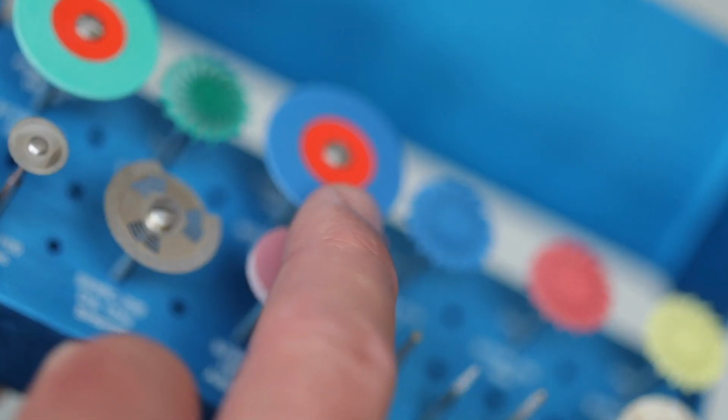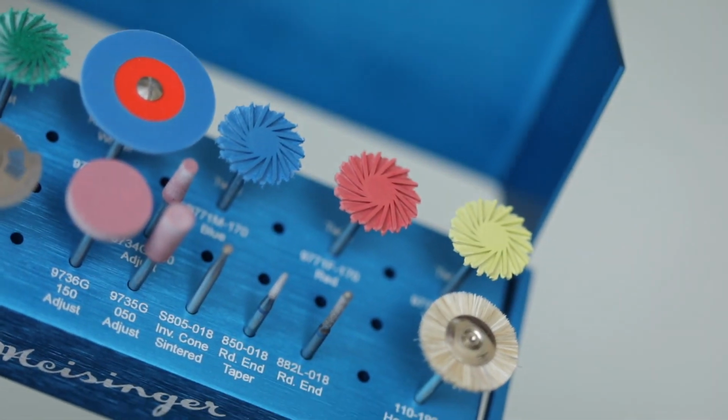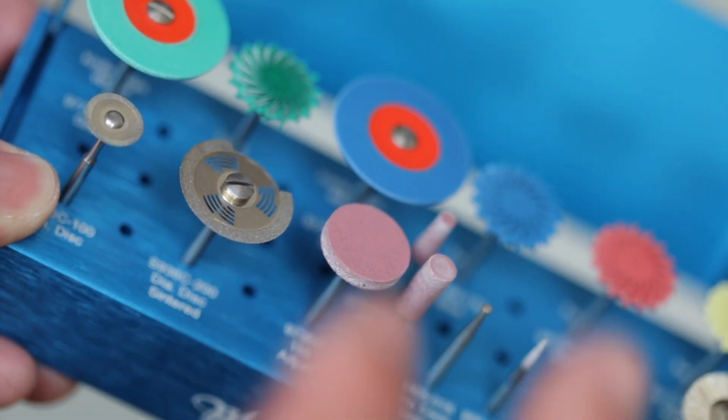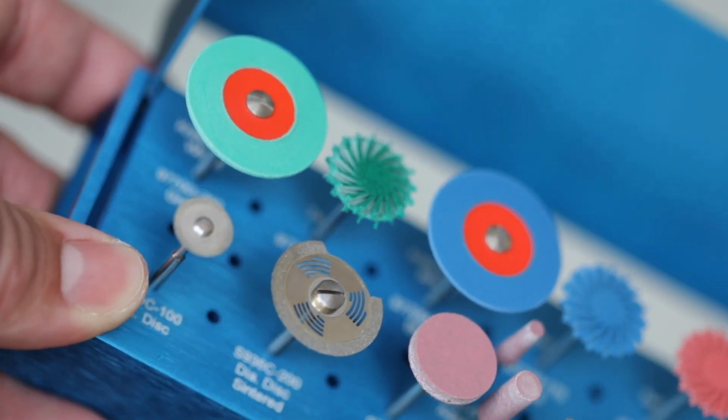Now if I go any finer, into the blue or the red or the yellow, then we're getting into a fine polish, and we don't want to do that if we plan on glazing the crown. So I'm going to stop here at the green pre-polish wheels.